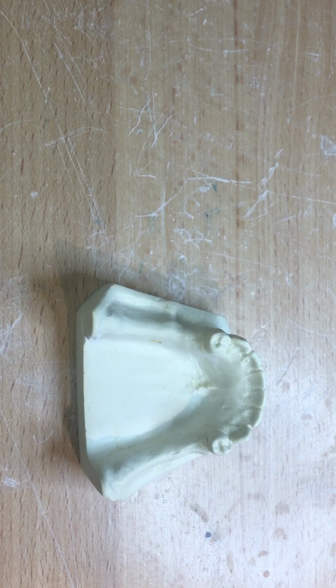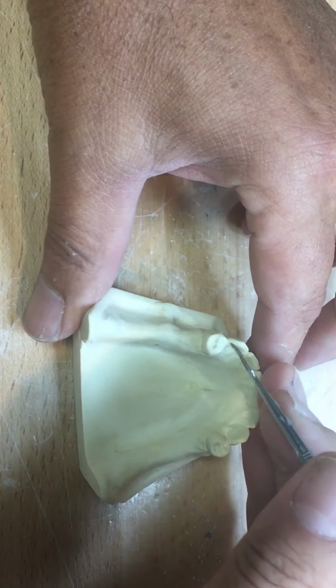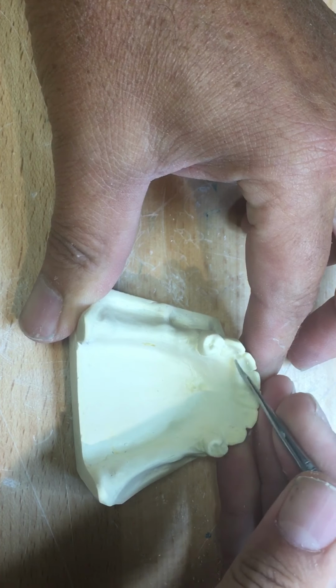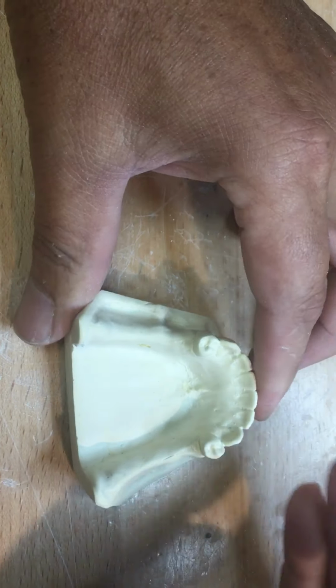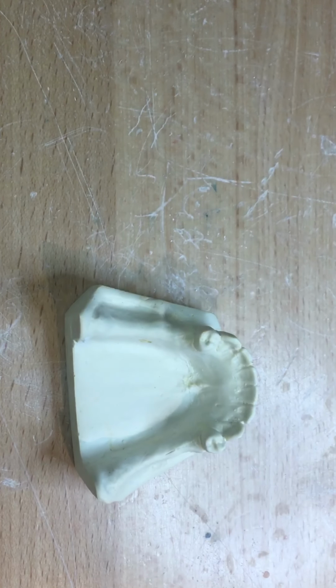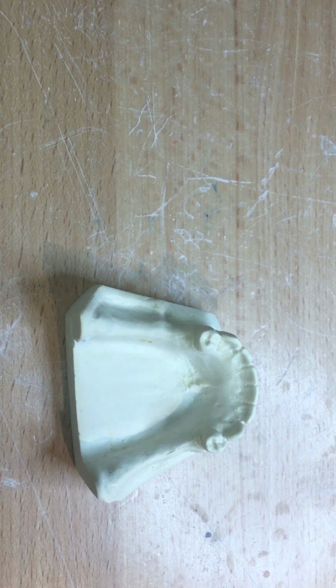Those bite registrations will either be centric occlusion or centric relation records. If it's a full upper dentition, a full upper dentition would take centric occlusion. If it's a denture, a full denture or a long span, meaning losing canine guidance of a Class 4, then it would be a centric relation record versus a centric occlusion record.